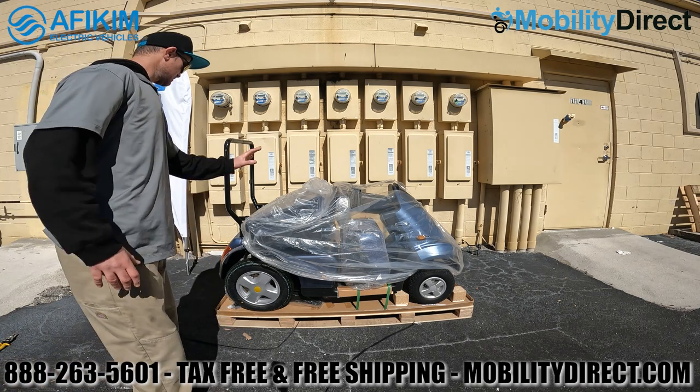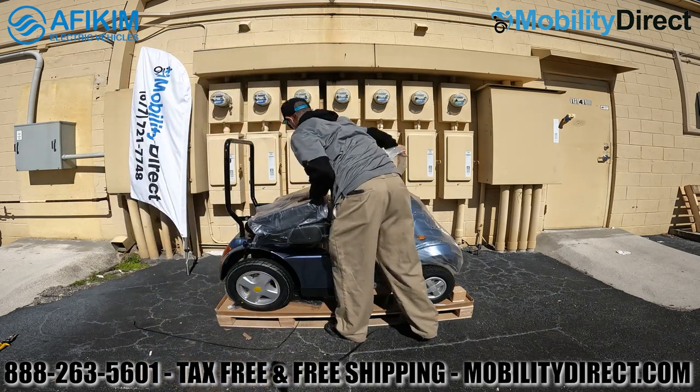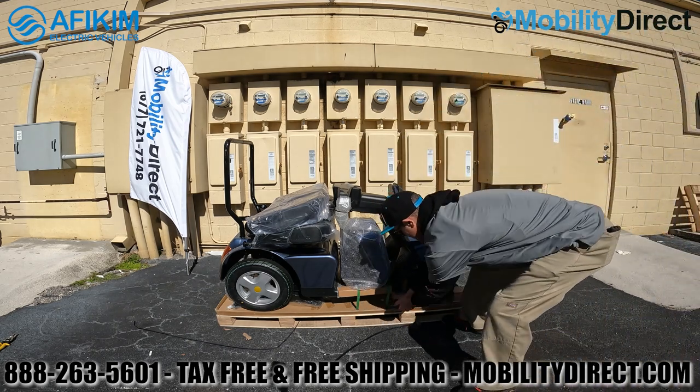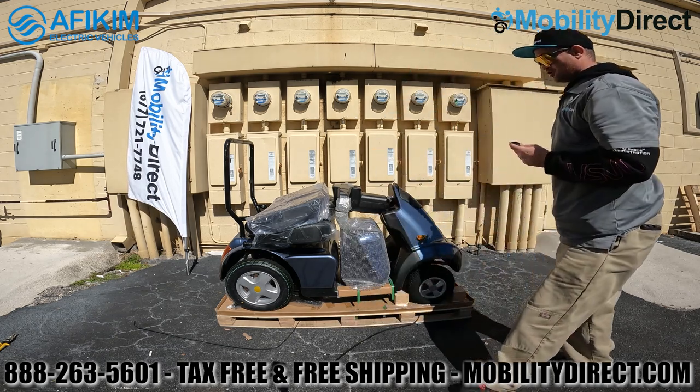As you can see, the scooter comes pretty much fully assembled with plastic sheeting around the entire scooter. There are also some straps that you'll need to cut carefully with a sharp knife — these secure the base footrest down to the pallet.